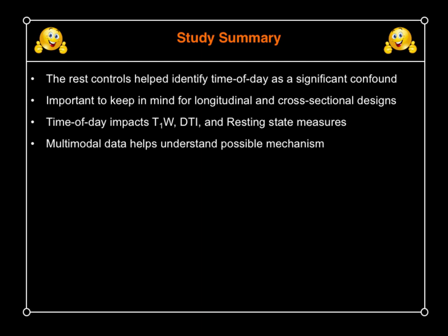And we were able to show that this is indeed related to CSF. With the resting state, we are finding large changes in functional connectivity. So there's some suggestion that there are blood flow related changes also that are associated with the time of day effect.